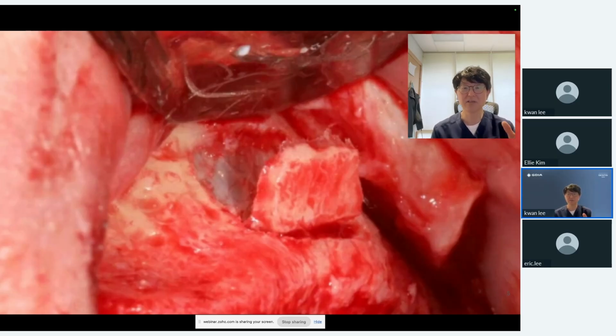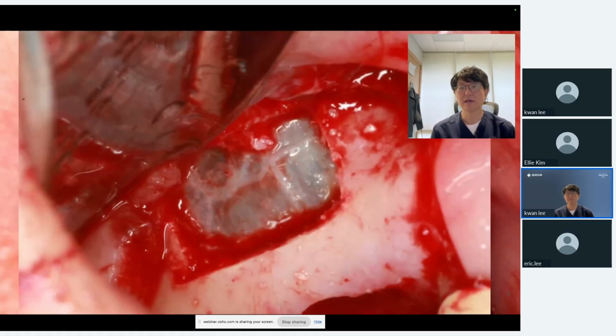You can cut through the lateral sinus wall very carefully and expose the Schneiderian membrane. Once the membrane is exposed, you can see the patient breathe in and out, and the membrane go up and down, up and down. For me, that's very good excitement. It's a sense of connectivity. I'm connected to the patient.